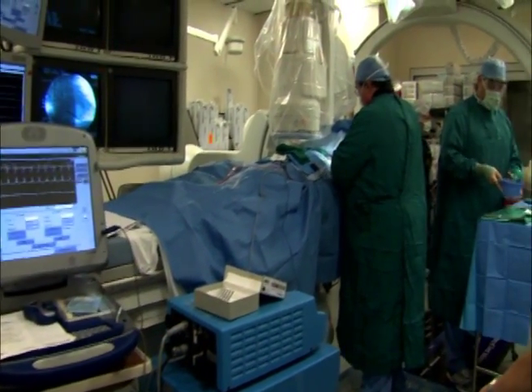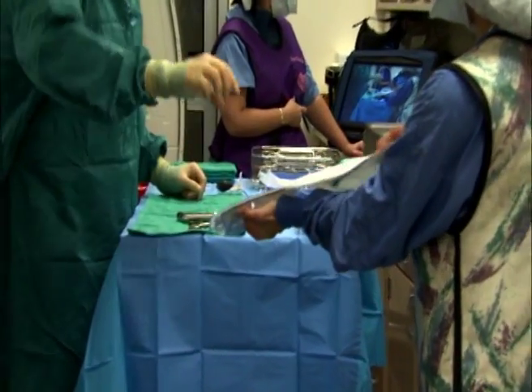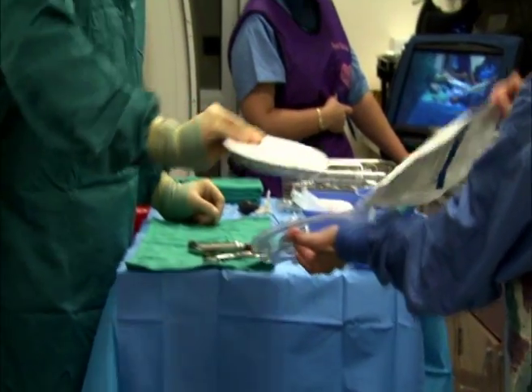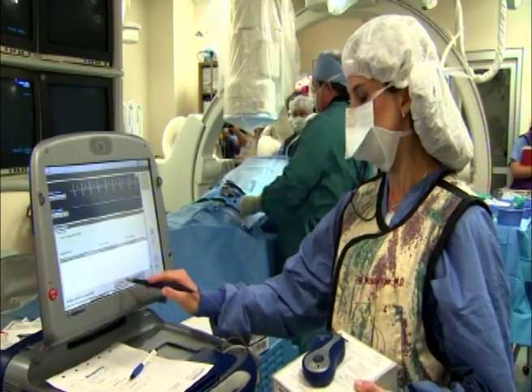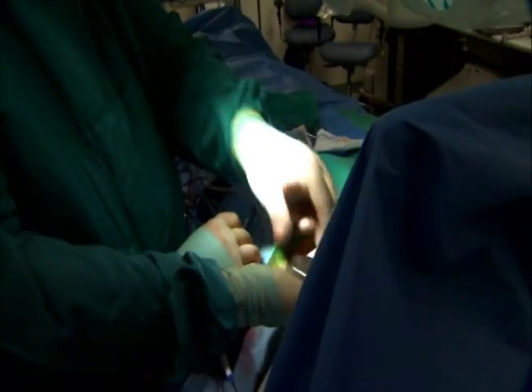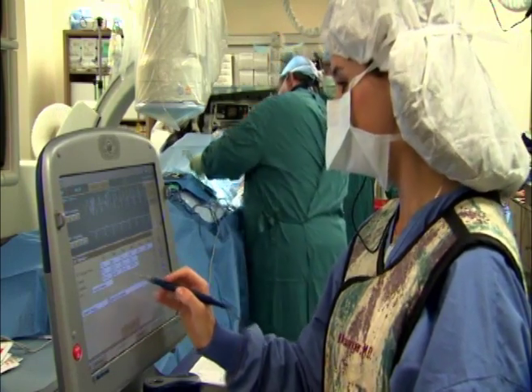There are some risks involved with an ICD system implant surgery. The risks include, but are not limited to, infection at the surgical site, sensitivity to the device material, failure to deliver therapy when it is needed, or receiving extra therapy when it is not needed. I was quite surprised that as far as pain goes, there was very little pain involved. It's probably one of the easiest procedures that I've ever had.